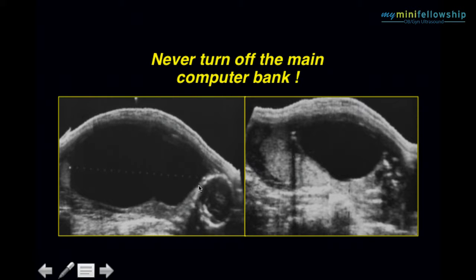You will notice that the fetal head, these small parts, are all excluded from the fluid that you see here. Every last drop of that fluid is in this fetus's abdomen, and we'll call it a bladder, but it's actually a cloaca. So this is a case of profound oligohydramnios that might fool somebody who's just going to measure this pocket diameter into thinking it's a case of polyhydramnios.